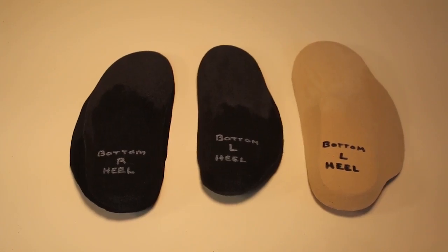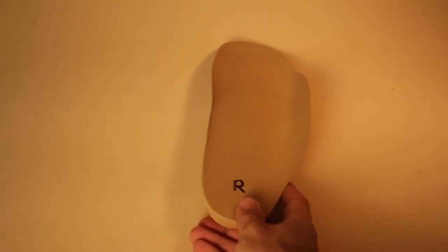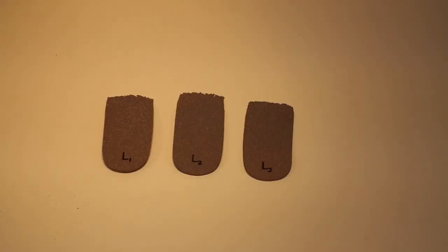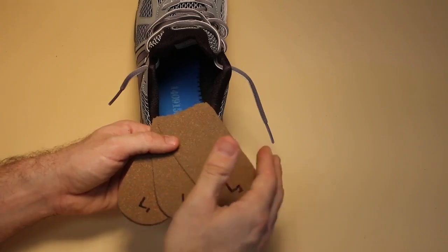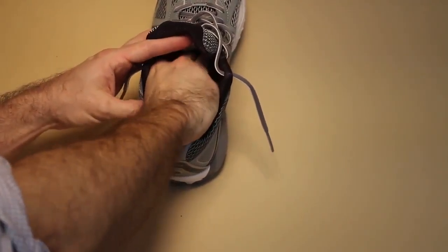Orthoses are marked on the bottom with indications for right or left foot and heel position. Sometimes these can be placed on the top if requested. Heel lifts: if you have documented a limb length discrepancy in your order and requested extrinsic heel lifts, these will be included in the shipment and must be inserted first.